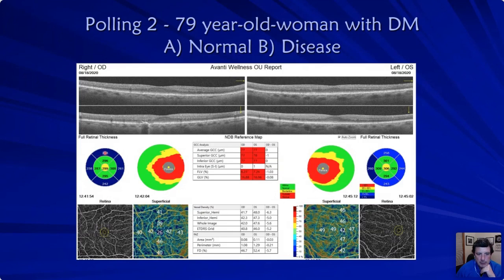Take a look here at the blue. It's blue. It's almost as if you can fold it in half, all within microns of each other. Now, I am going to point out there's a little RPE scar going on here. There's something going on. But is this yellow, red, green, blue, is this all being thrown off by this? No, there's an RPE scar going on here from something. But is this a glaucoma patient? It's saying, hey, doc, look, it's pretty thin, but it's also globally thin, too.